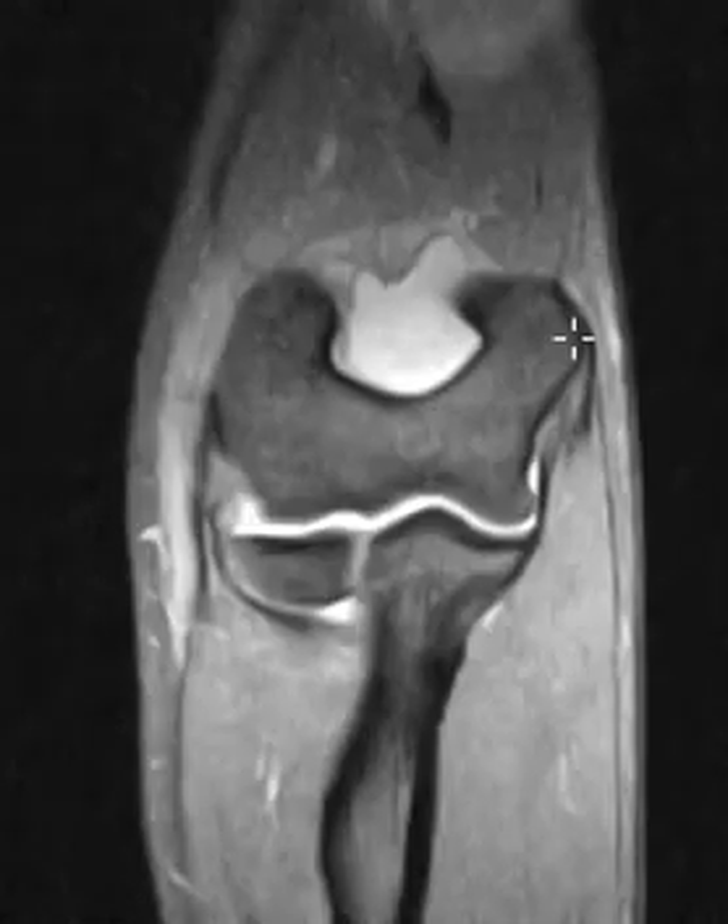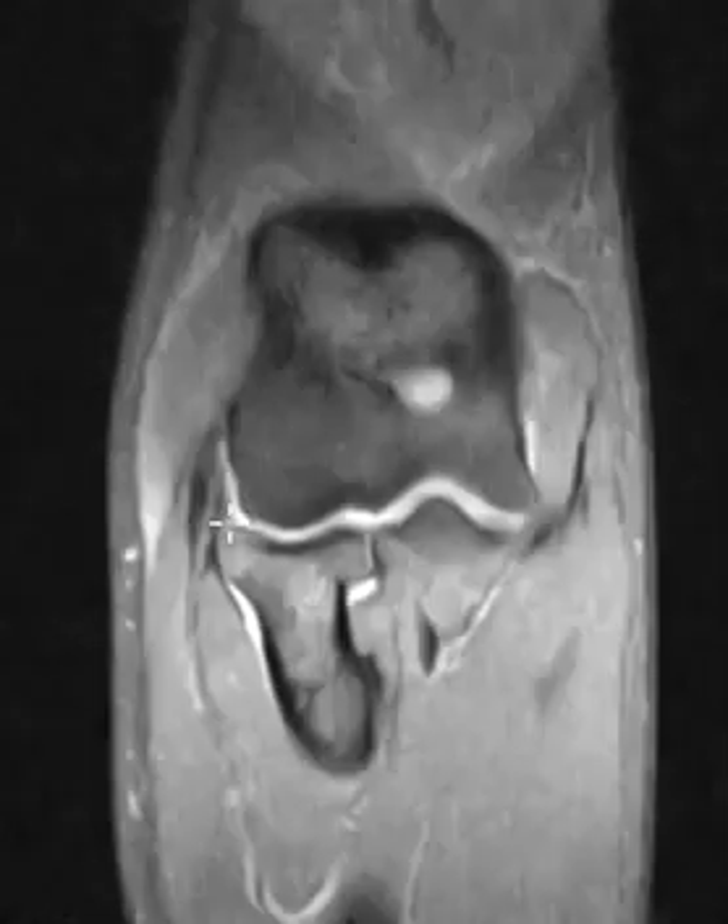So this is the medial epicondyle. We have the medial ulnar collateral ligament coming down here, attaching to the pointy thing — the sublime tubercle — looks completely normal.